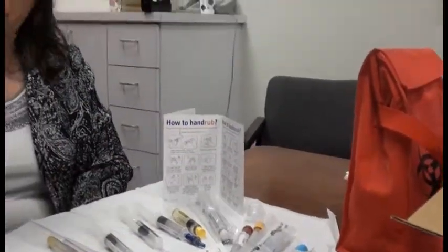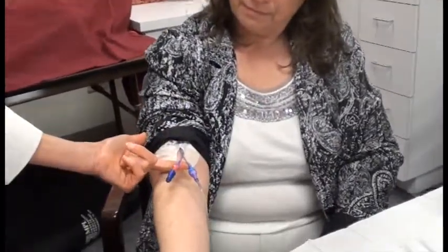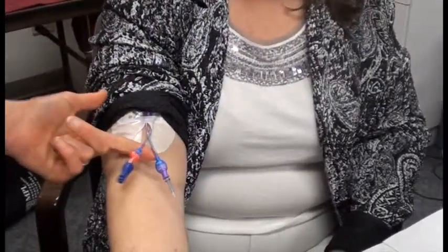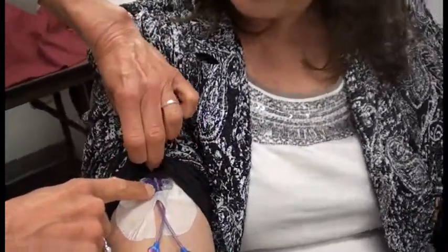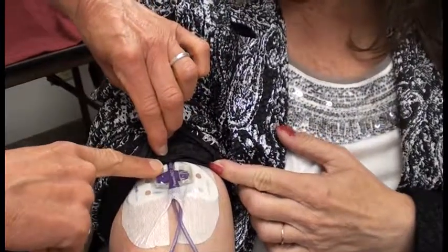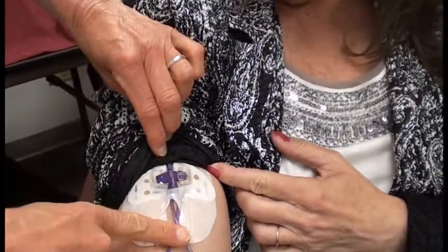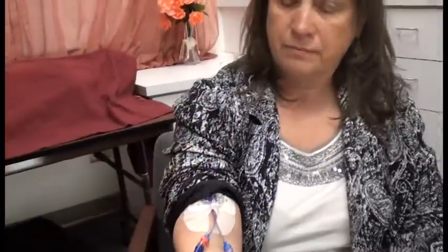All right, do I have a valved or a non-valved PICC line? That's the question. The first thing you look for is, is it clamped or unclamped? It is not clamped, so we know it's a valved catheter. And then you read the line to determine it is a Power PICC Solo. So that's how you can tell exactly what kind of line you're dealing with. Clamps or not clamps, and then read it. That identifies your line, and so in this case, heparin would not be needed.